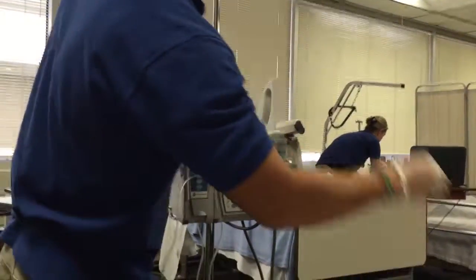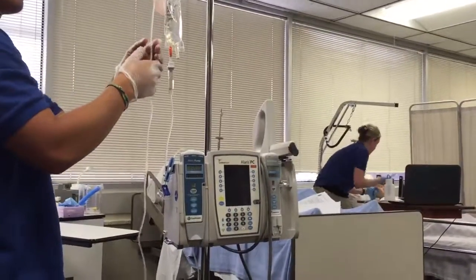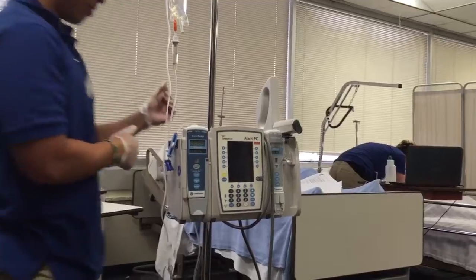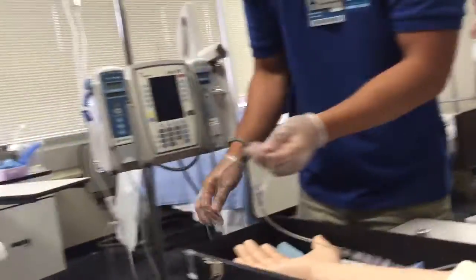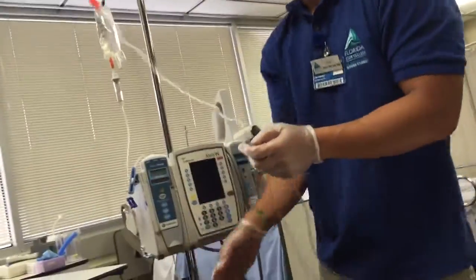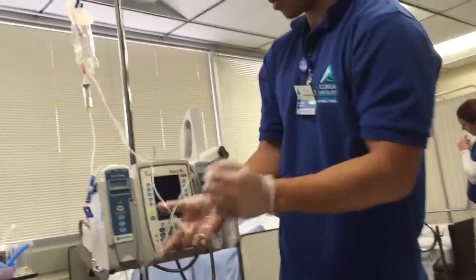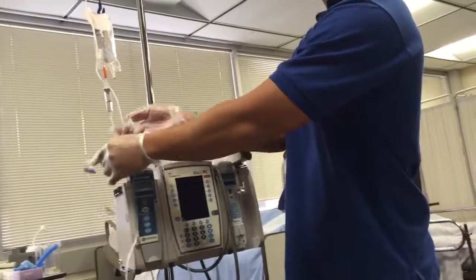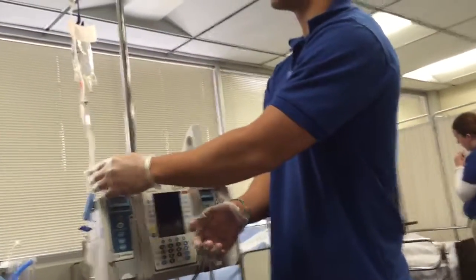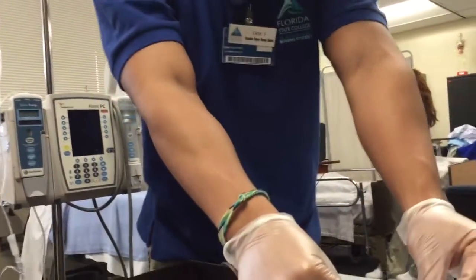That's good. I'm going to unclamp my piggyback to make sure that it's running, which it's not running yet, but it will. So I'm going to go ahead and unclamp this. I'm going to go ahead and unclamp all of the clamps on the primary also. Here it is. So I'm going to unclamp that. So then I'm going to observe to make sure that's running, which it is. It looks good. I'm going to go ahead and inspect the site, which looks good.